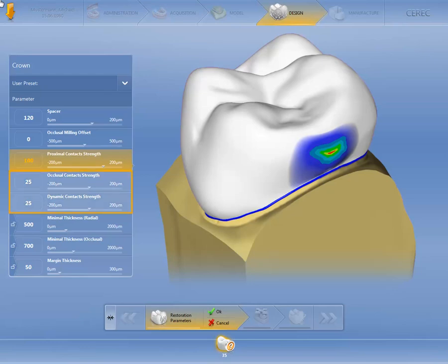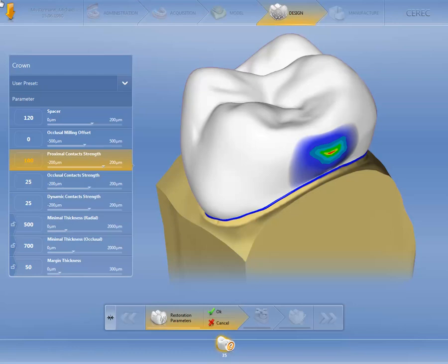This is also the case if you change the local parameters for the occlusal contact strength, the dynamic contact strength, or the locked setting for the margin thickness. It is therefore important that any changes to the local restoration parameters be made before revising the initial suggestion, as otherwise the adjustments made using the various tools will be lost.